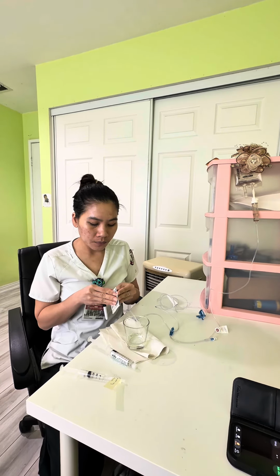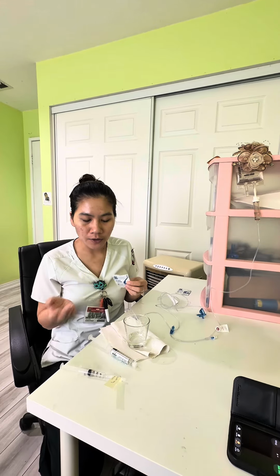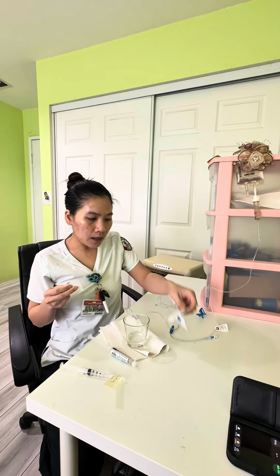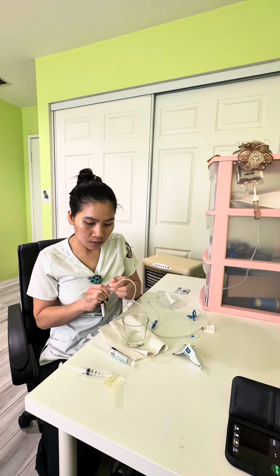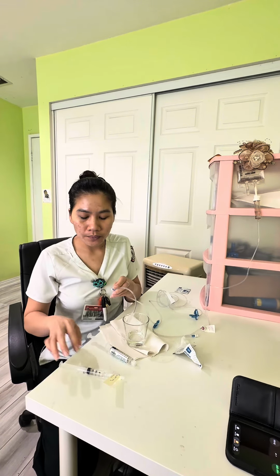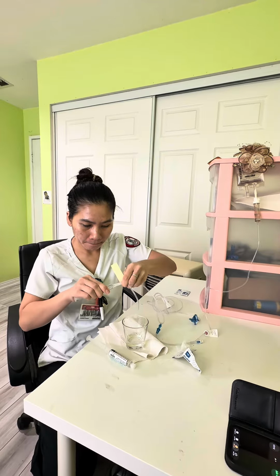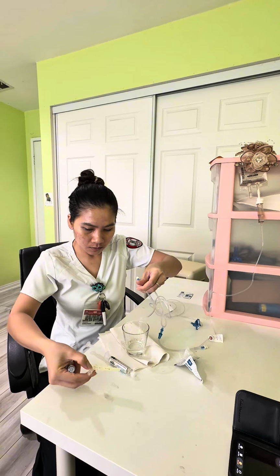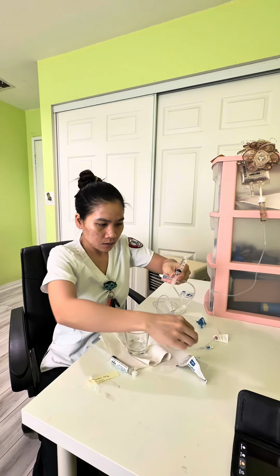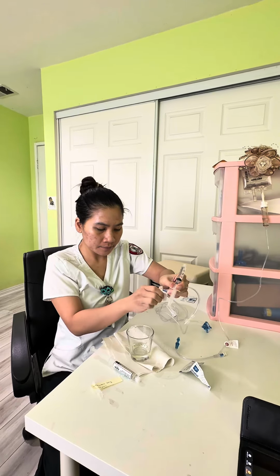Since the tube is running at TKO, I don't need to adjust the rate of the solution. But if the solution is running too fast, I have to adjust the medication rate to be able to give the correct dose. So I go ahead and clean the port. This one is 4 milliliters over 2 minutes. Clean for 10 seconds, and then allow 10 seconds for it to dry.